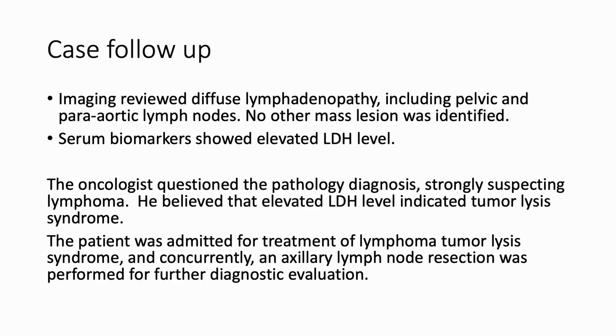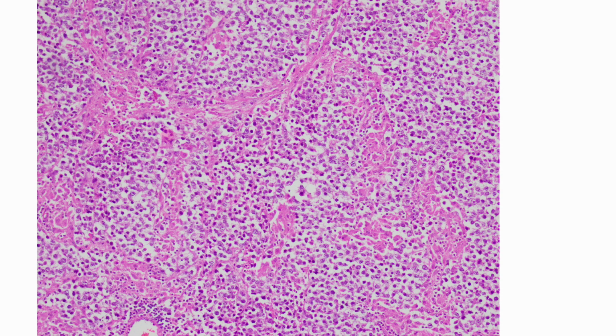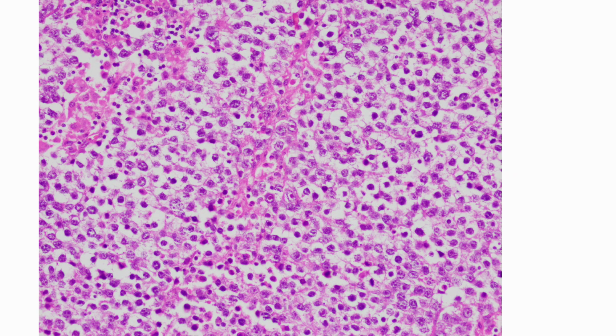The patient was admitted for management of tumor lysis syndrome, and a resection of an axillary lymph node was performed for further evaluation. On the resected lymph node, we observed sheets of tumor cells separated by incomplete fibrous septa, with small lymphocytes present within the fibrous bands. In this picture, we can better appreciate tumor cells with incomplete septa, as well as small lymphocytes inside the septa. At high power, the tumor cells were uniform, with prominent nucleoli and moderate clear cytoplasm, giving a classic fried egg appearance. So what's the diagnosis based on morphology?